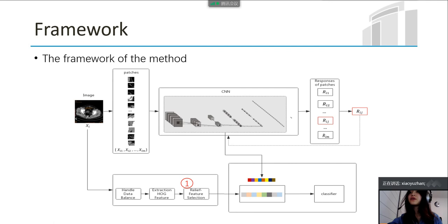After that, we use the Relief algorithm to assign weights to the feature set and then select the high-weight global feature set. The optimized classifiers SVM and RF are used to classify and compare the results of the combined feature set.